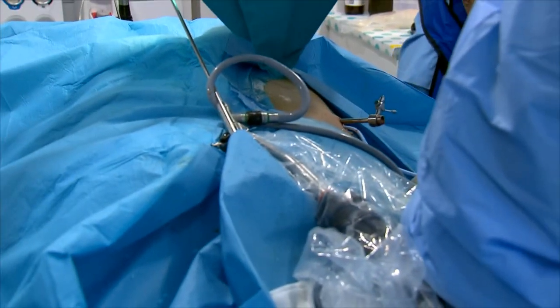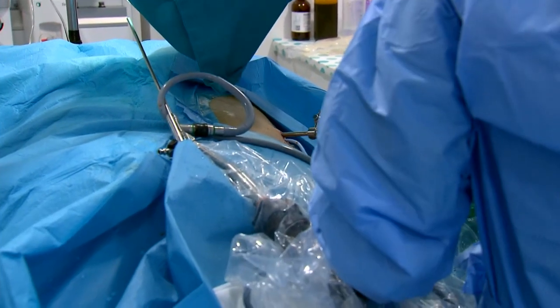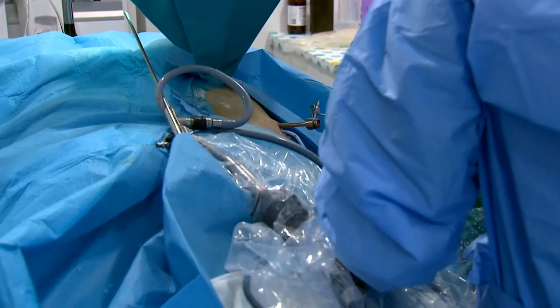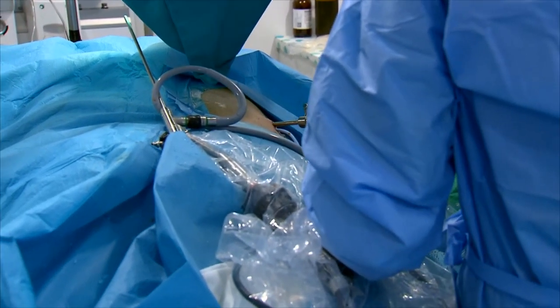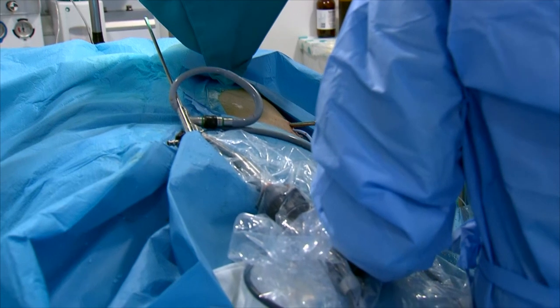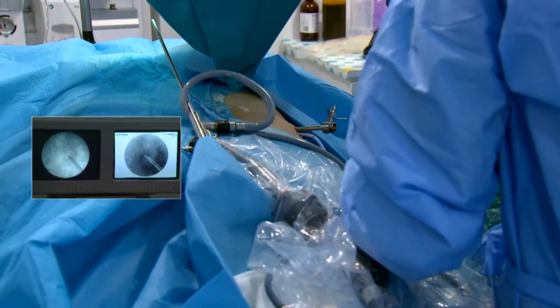Yes. It depends on the space. Sometimes it is 3, 4, 2. It depends on the space. And I'm going to have a look at the space by contrast dye. There is okay, a commentary in the room. That's all.